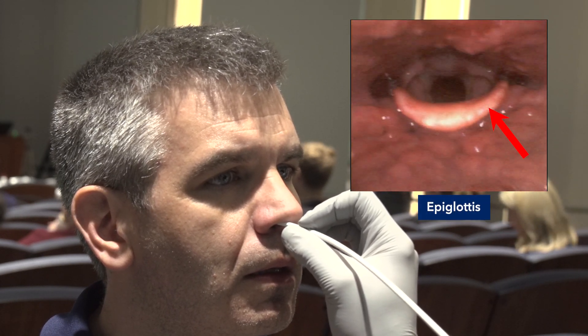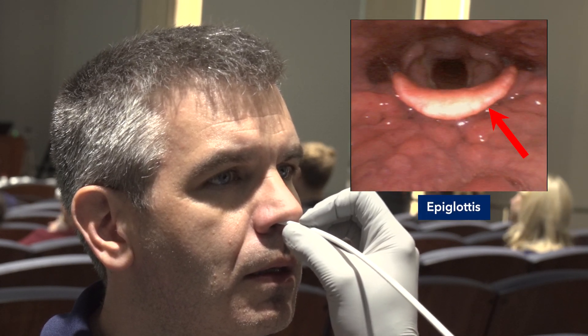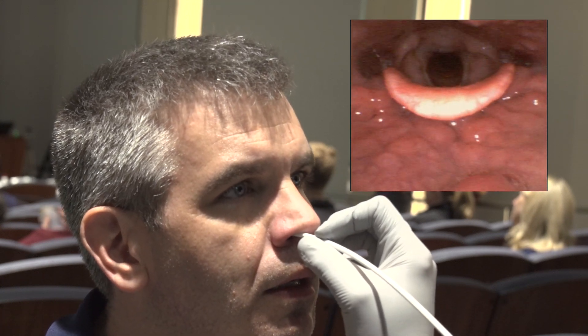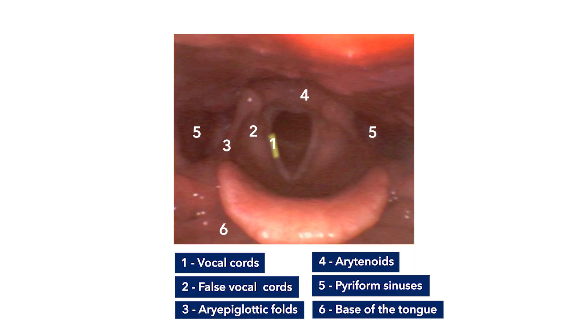Trying to keep your target in the center of your screen, advance your scope, identifying the vocal cords, the false vocal cords, arytenoids, and tracheal rings.